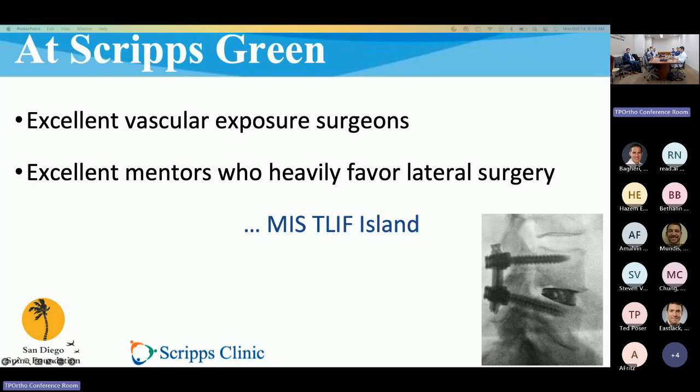So this is a patient who was 55 and had adjacent segment disease from prior ALIF and some bilateral leg pain. Here, and I think Tim, you actually wanted to research this, but this is a patient that had an ALIF, and sometimes when you're doing ALIFs, which is not something you have to worry about when you're doing TLIFs, you could have some foraminal encroachment, and it can be from a spondylitic spur, like seen here, or it can be from the SAP. If you put in a 20-degree cage, you can get the SAP sort of projecting into that foramen. And so there are downsides to other approaches.